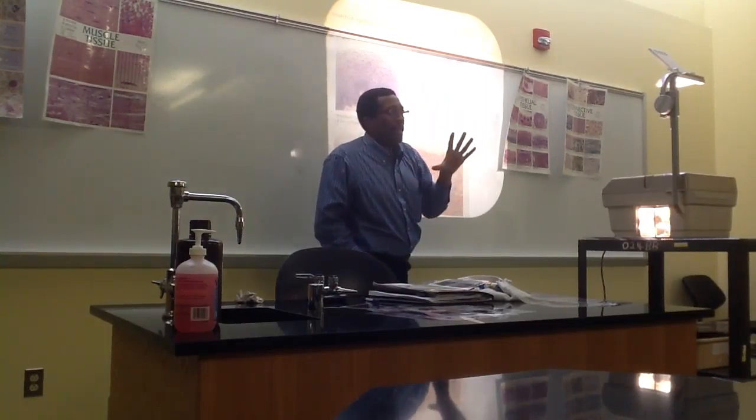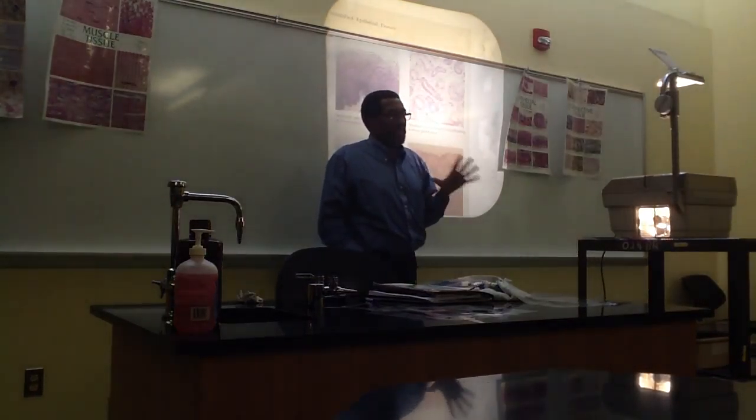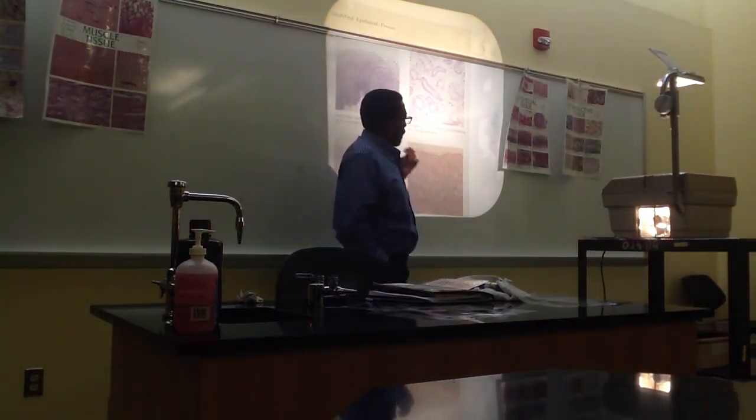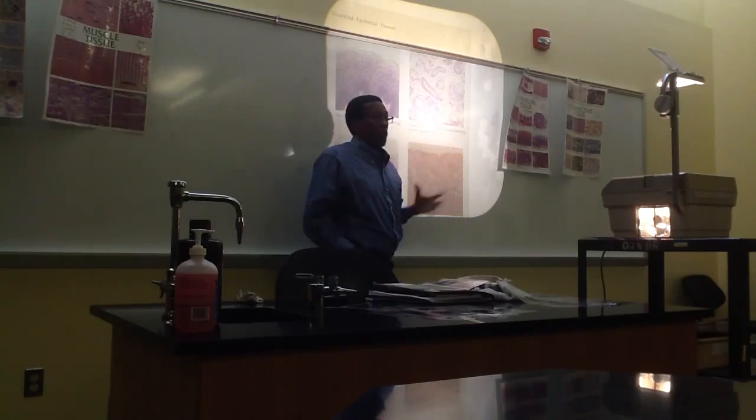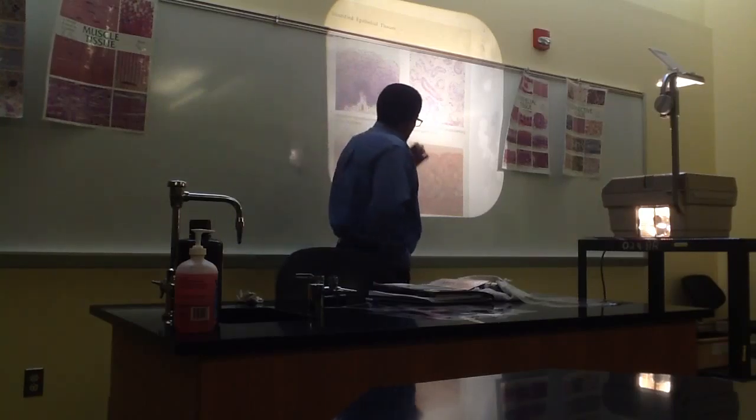So notice the methodology that we're using. We're not just guessing at the tissue. We're looking at identifying characteristics and then applying what we know.